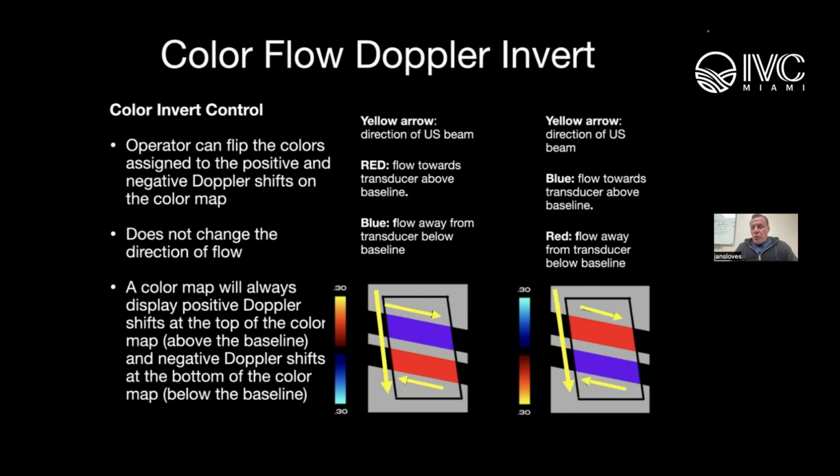well, first, we were kind of taught, right, that you want to keep arteries red and veins blue, right? But you have, again, depending on how you're steering your transducer and the way that you're going to insonate these vessels, it is subject to change, right? So even if you're in a situation where maybe you're dealing with a couple of vessels that are tortuous, and now all of a sudden the vessel's going in a different direction, subject to change.